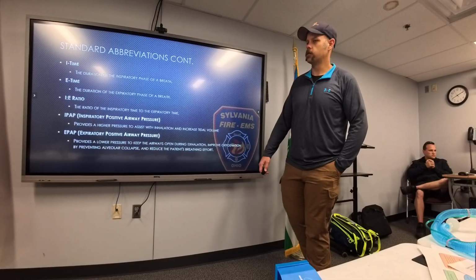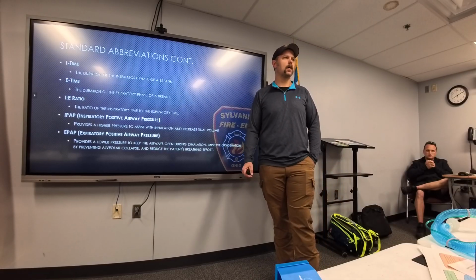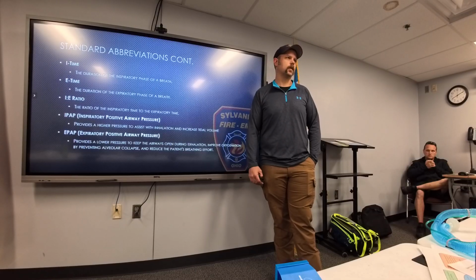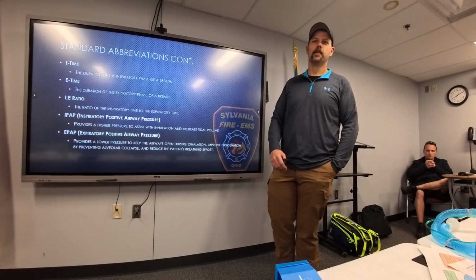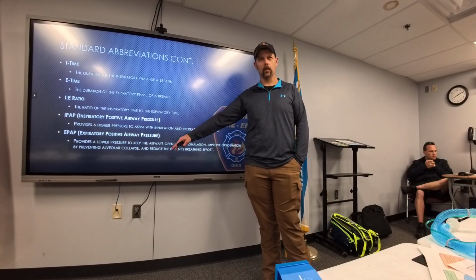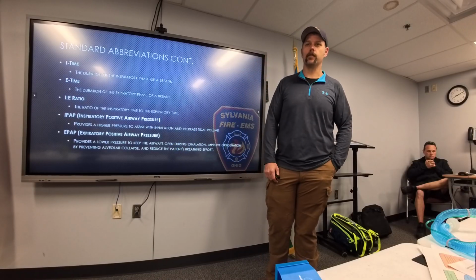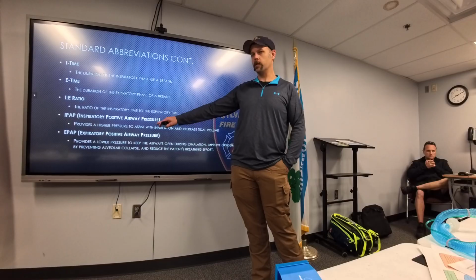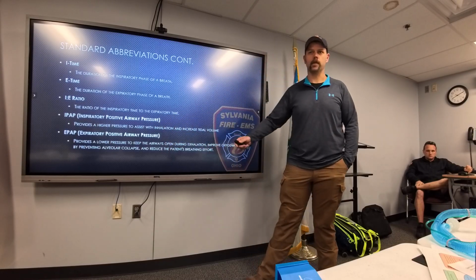Also, who's heard of the BiPAP settings, like when we go into the hospital and say, okay, let's put them on BiPAP 12/6? Anybody ever heard that before? Kelly, I know you have. So those settings, those numbers, are our IPAP over our EPAP. For example, our protocol starts at 10/5. So they're going to have an inspiratory pressure of 10, expiratory pressure of 5. So their PEEP is going to be 5, essentially.